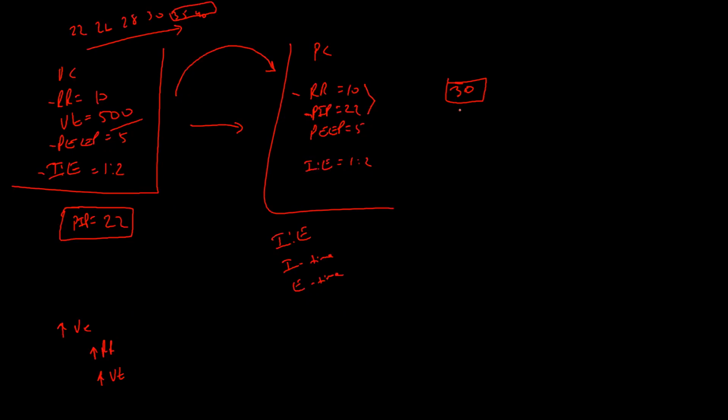What we find out when we do that is our tidal volume goes from 500 down to 450, down to 400, down to 350. You see what I mean? Because the lungs are getting stiffer and it's putting in the same amount of pressure, but the lungs, because they're stiff, can't hold as much volume with that same amount of pressure. And so we realize that the CO2s are going to rise. But we're still going to maintain this patient. The patient's going to be really sick for a while.